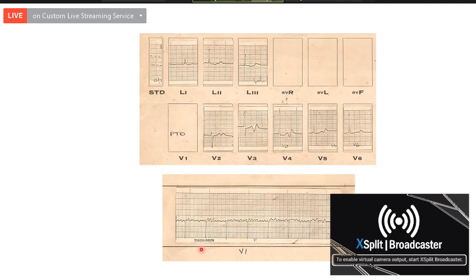Because we do not know whether the patient has received digitalis, but looking at the setup and the criteria, you can diagnose associated digitalis toxicity. Okay, very good. Next one.